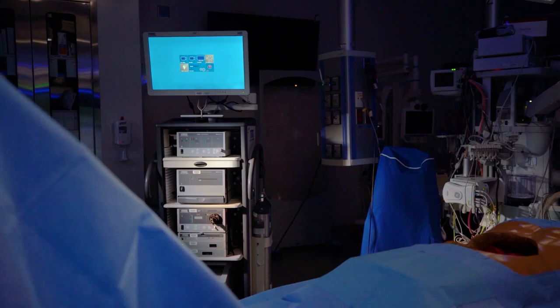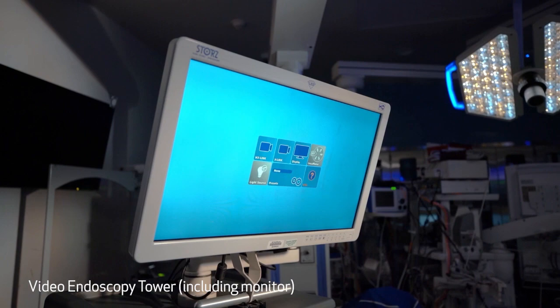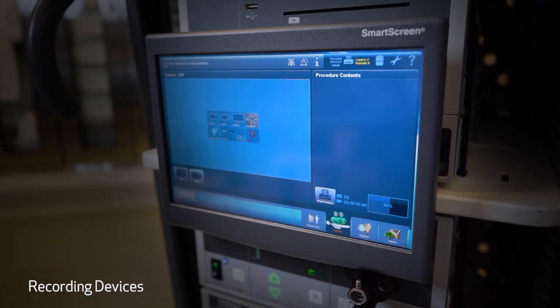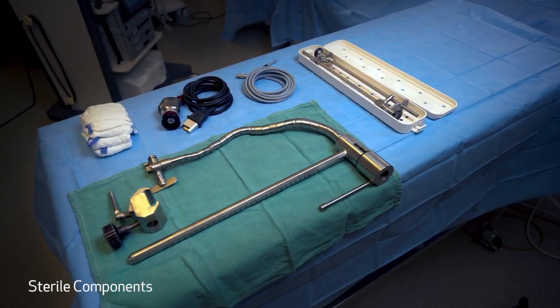Here is the basic setup. The components you need to record a procedure include a video endoscopy tower that includes a monitor, a recording device, a camera unit, and a light source. In addition to this, there are sterile components that can be used.